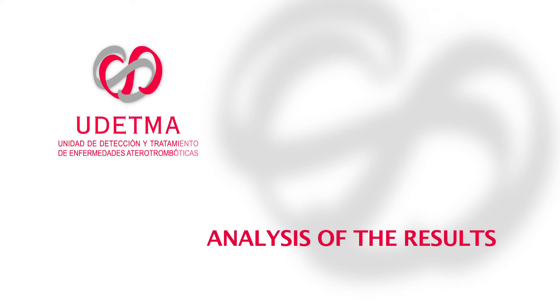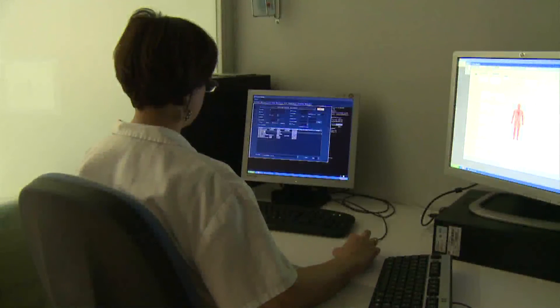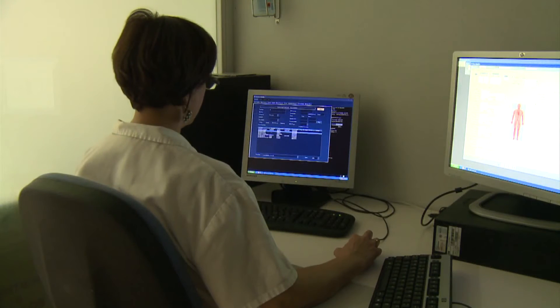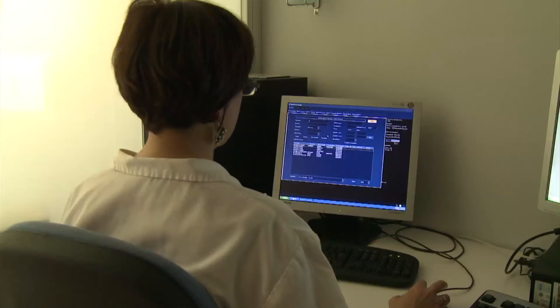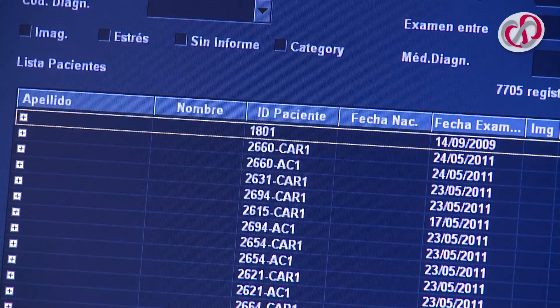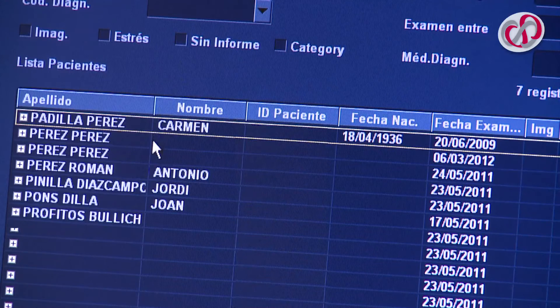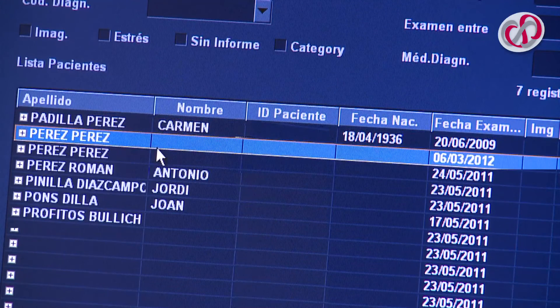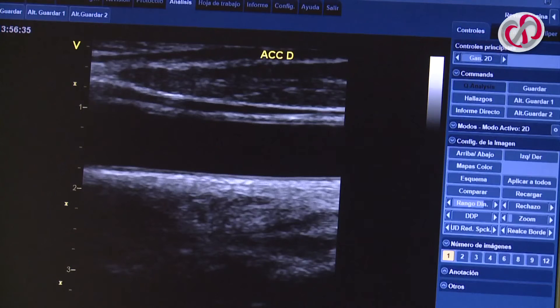Analysis of the Results: At a later date, the exploration is analysed on a central image reading unit. Step 1: Enter the reading programme. Step 2: Select the patient and open the study. Step 3: Once within the study, select the image to evaluate.